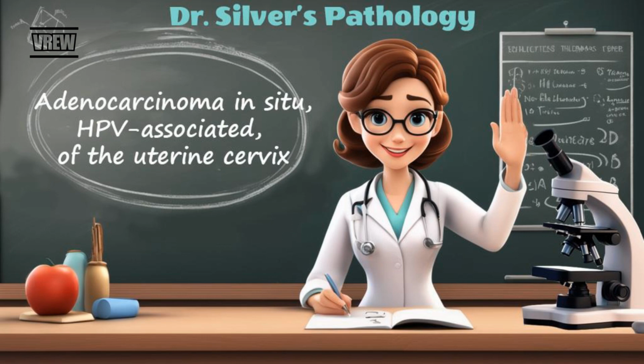Dr. Silver's Pathology. Adenocarcinoma in situ, HPV-associated, of the uterine cervix.